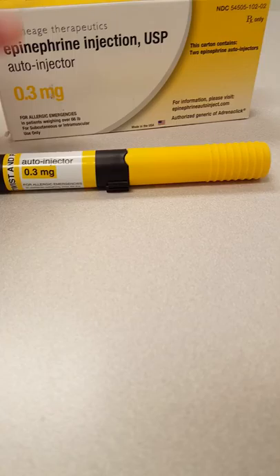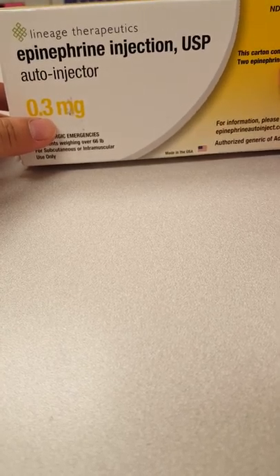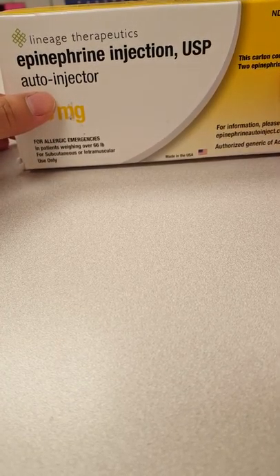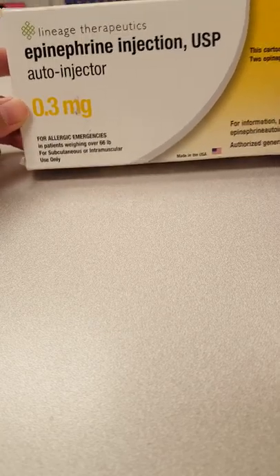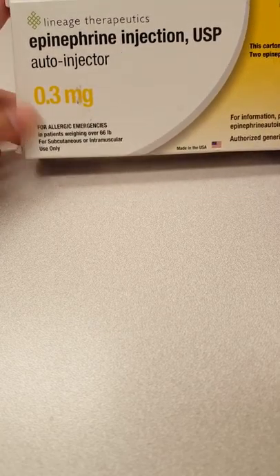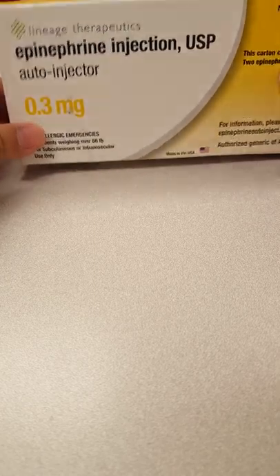The instructions here — this is for adults. This is a 0.3 milligram epinephrine injection auto-injector. This is for allergic emergencies where someone is demonstrating anaphylaxis.